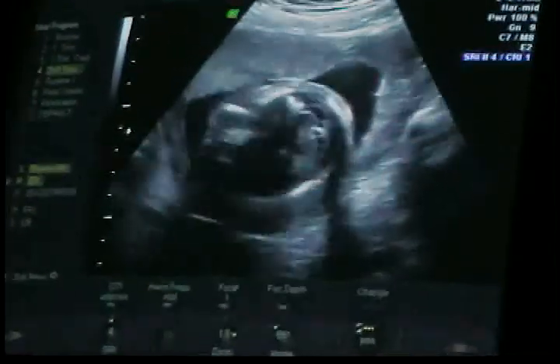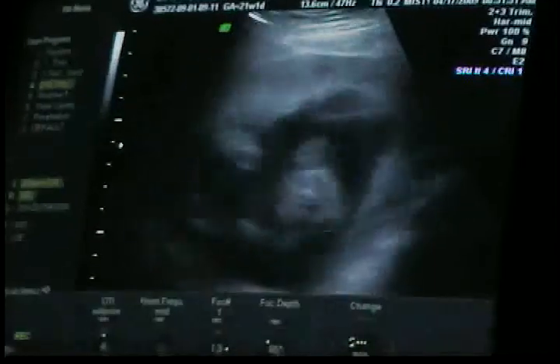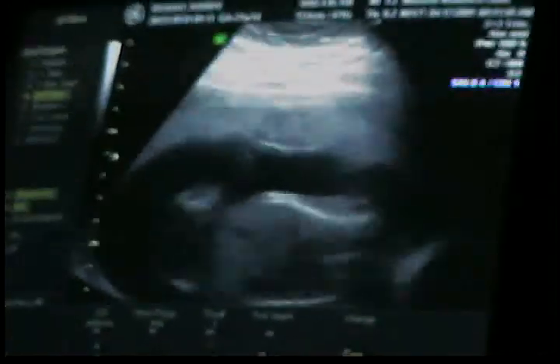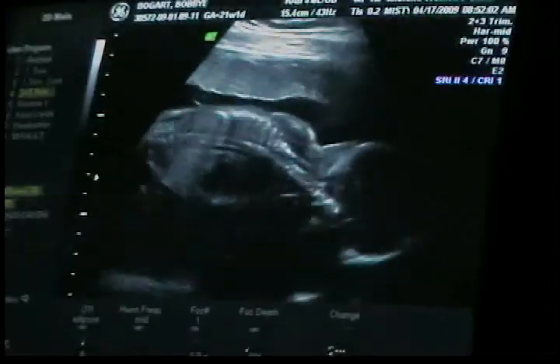And then we're going to do all of our measurements here. I'm trying to get on the top of the head. Head is low. Go ahead and just lower that a little bit. Which end is the head on? He is low. Is he over here? Body is mostly over here. Oh, okay. It's on the left side. There's some movement.